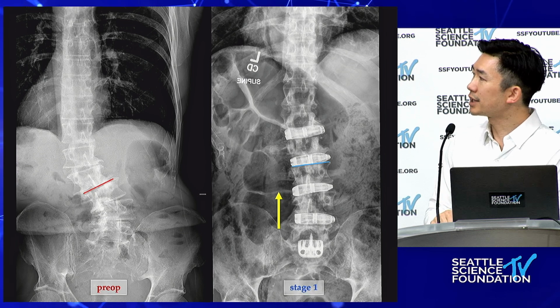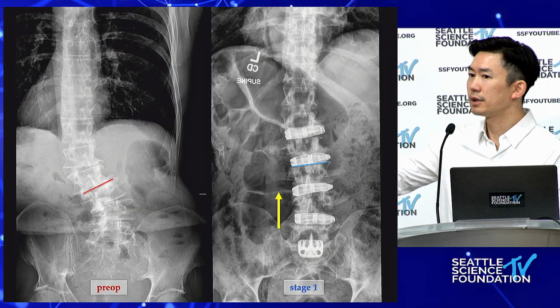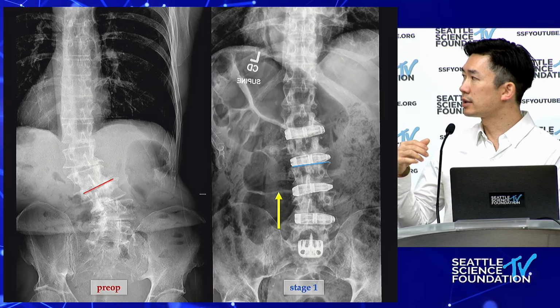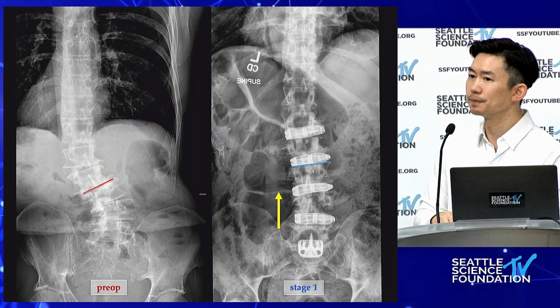But I think about the same thing because you can certainly naturally throw this person completely off to the wrong side. And so for the coronal taper cages, that's definitely been helpful to try and push them up on that lower side to avoid kicking them off to the wrong side.